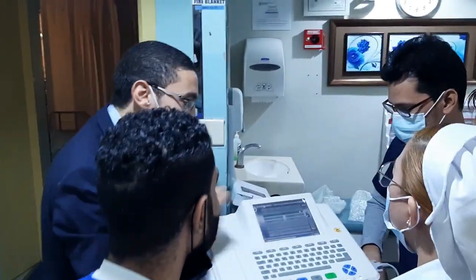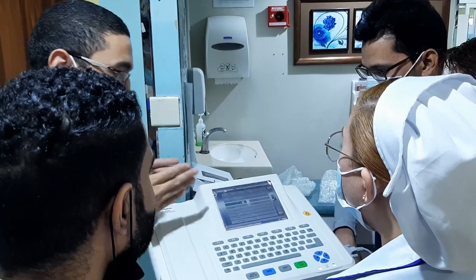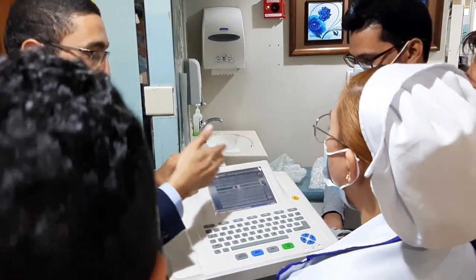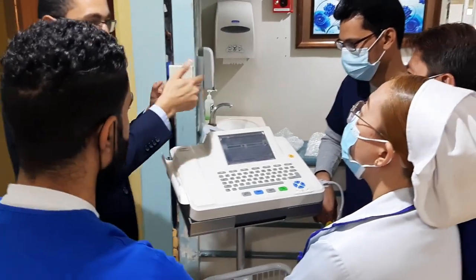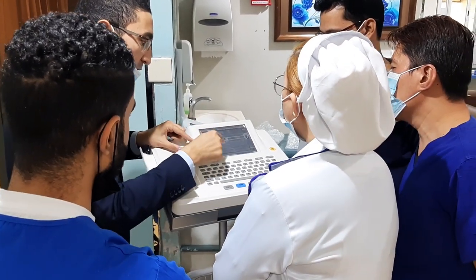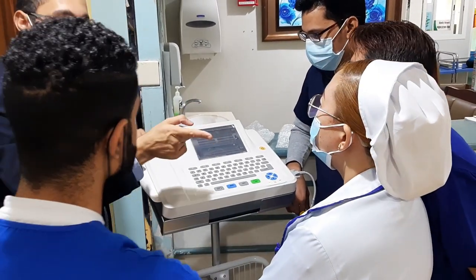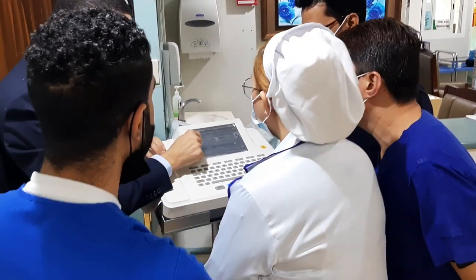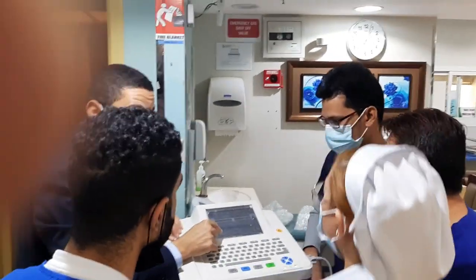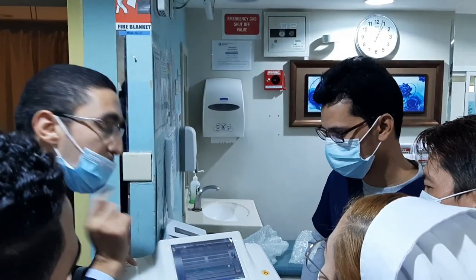Okay, go to the next step. So enter the H as example. H, H, okay? The information you want to enter, you can enter. The information you don't want to enter, no need. Skip. No need height, no need weight, system. No need, but hospital number, you can enter the file number. You can go to hospital number or bed number.